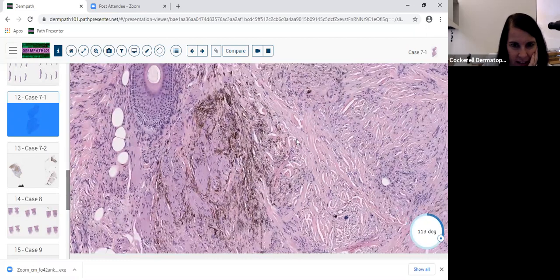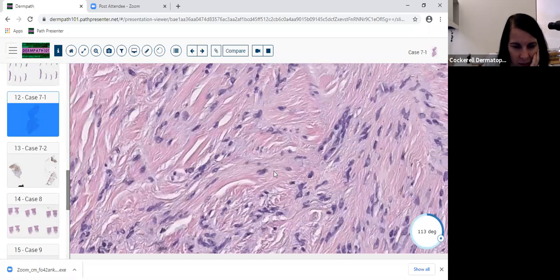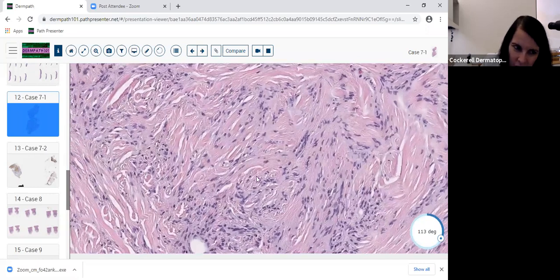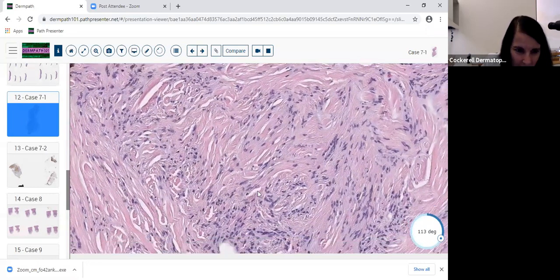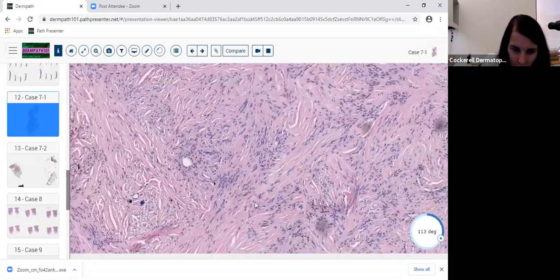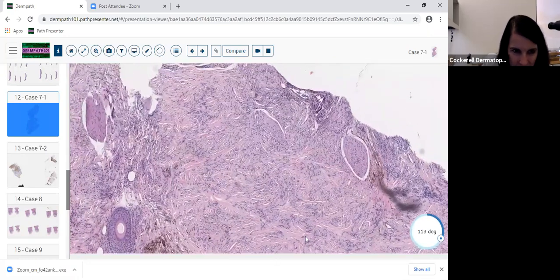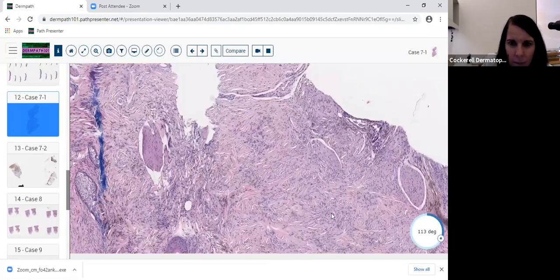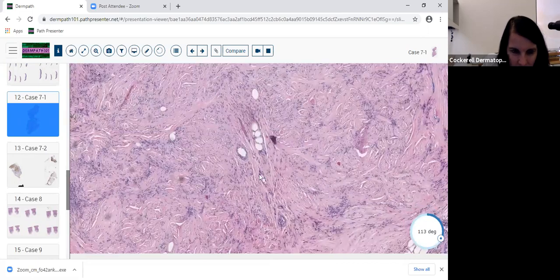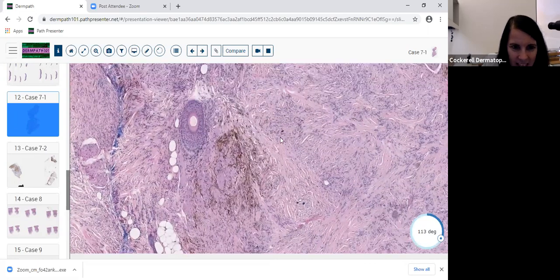And then the rest of this has these pale cytoplasm and these spindled cells with these interlacing fascicles. It's not storiform to me, and the NC ratios are not very high at all. That's why I'm not thinking about a DFSP and saying, oh, is this a Bednar tumor? I'm not thinking about that at all because these cells don't have high enough NC ratios for me to think about a DFSP here. And it isn't beautifully storiform like I like to see with a DFSP. And with these dendritic processes, these slender filled with melanin, I'm thinking about a blue nevus.